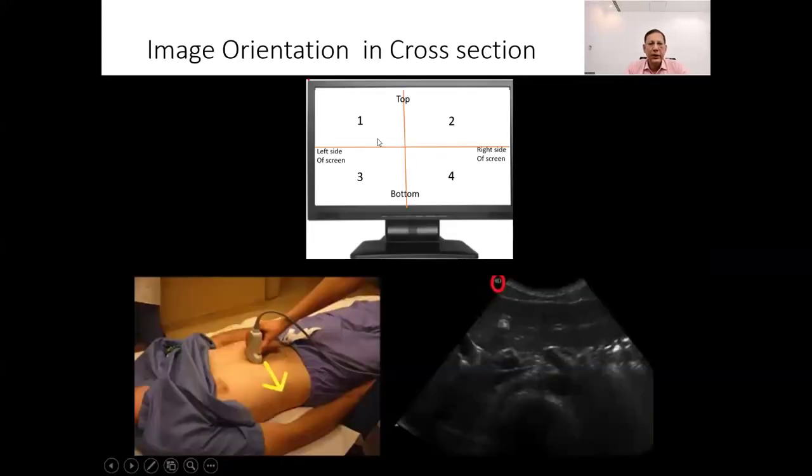The position of the indicator on the transducer corresponds to the position of the indicator on the screen. Since the screen indicator is on the left side of the screen, which corresponds to the patient's right side, the opposite direction corresponds to the patient's left side. In cross-section, the indicator on the transducer points towards the patient's right, so what you see on the right side of the screen is actually the patient's left side.